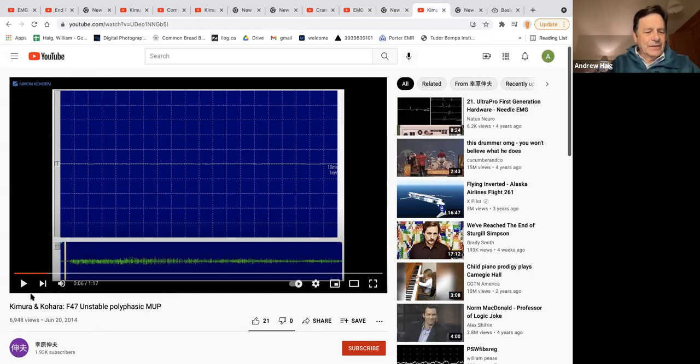Okay, so here's a polyphasic. And Jun Kimura, he's one of the great leaders in EMG and an old friend, wrote the textbook. If you want to buy a textbook, buy Kimura's textbook. He not only has a motor unit here that's polyphasic, but if you're really clever, what he's trying to show us experienced doctors is that some of the muscle cells are firing sometimes and then not firing because the motor end plates are so unstable. So you'll see that maybe the amplitude changes or a little spike as part of the motor unit shows up and doesn't show up. Really what I want you to see though is a polyphasic motor unit.